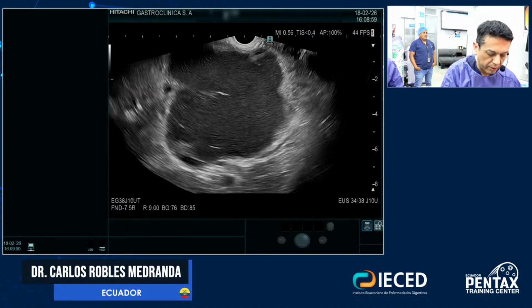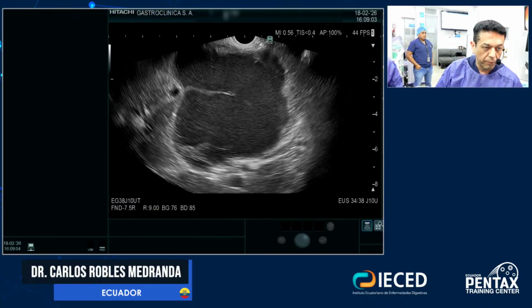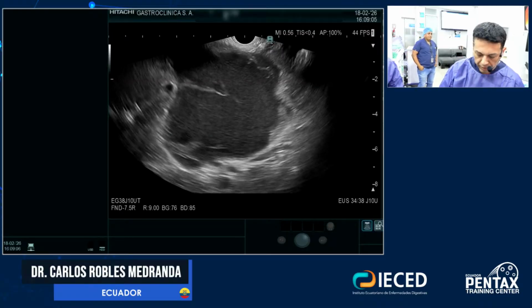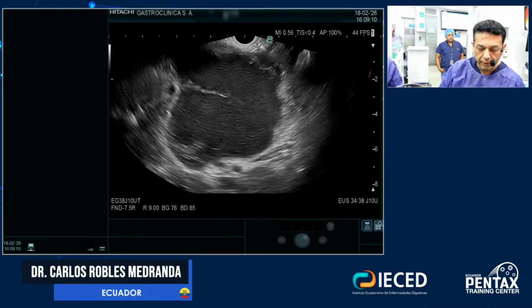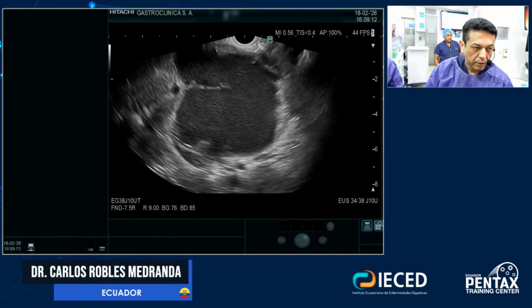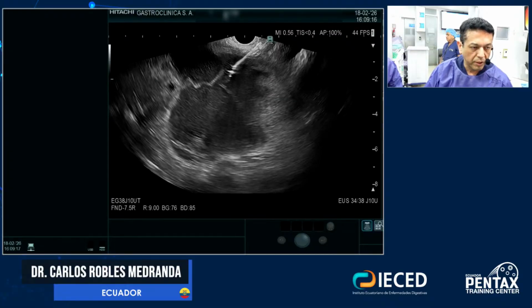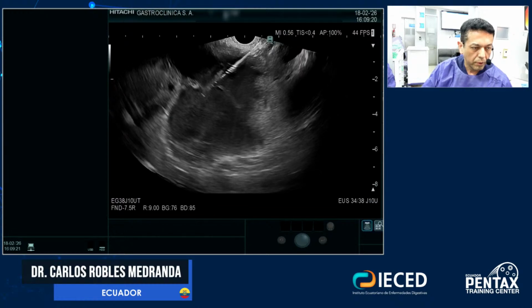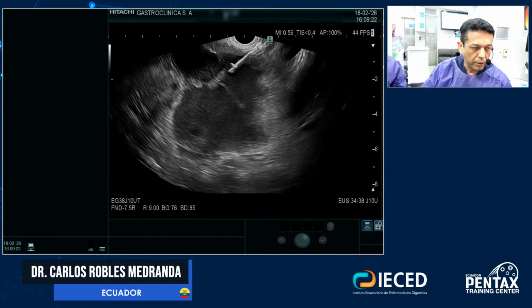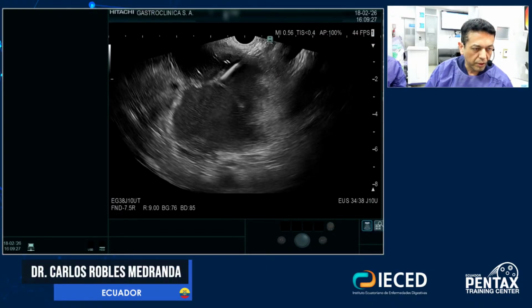As you said, tissue is the issue in the United States, for example. So in my opinion, because of AI and the microvascularization, this patient has a mucinous lesion. You see, I'm there. I will push my confocal. Okay, I will try to go a little bit deeper just to see the wall.